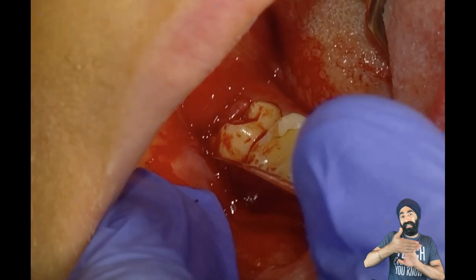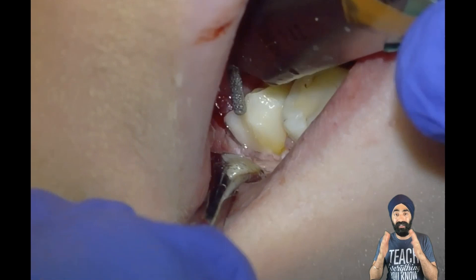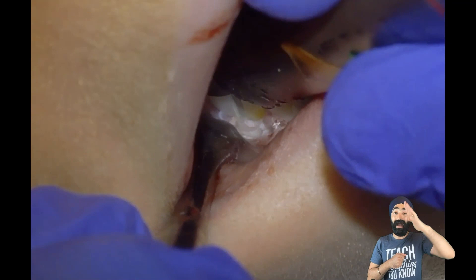Now that the flap is reflected, I'm going to select my burr and handpiece. I use an electric handpiece — speed increasing — so there's no air. And I use an angled one, 45 degrees, which helps me to get a good position.